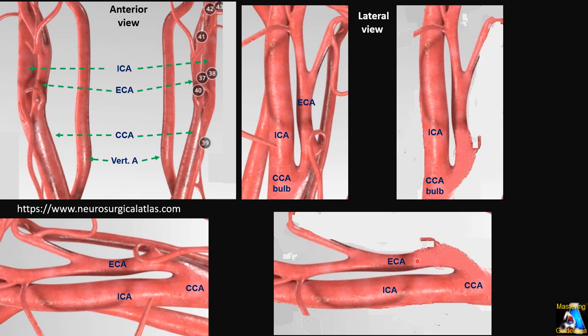Join these two images together in your mind — keep in mind how ECA and ICA look relative to each other — and when you scan it will be a piece of cake. What maneuver should you do if you want to get the ICA? For example, if approaching laterally with your sound beam this way, just fan a little up to your right side to get the ICA. If you fan to your left side or down toward the bed, it becomes the ECA. I'm going to explain exactly the two or three techniques for catching each of them.